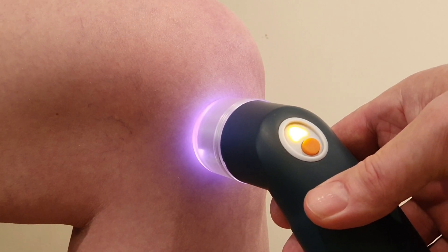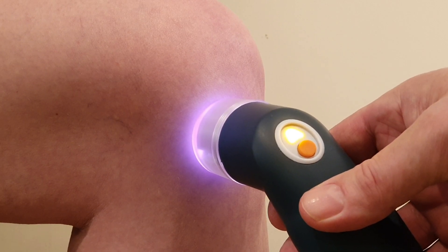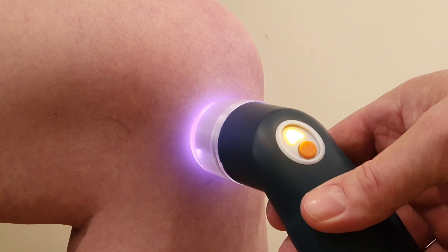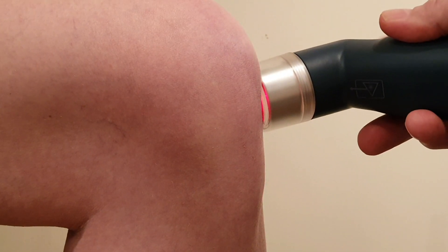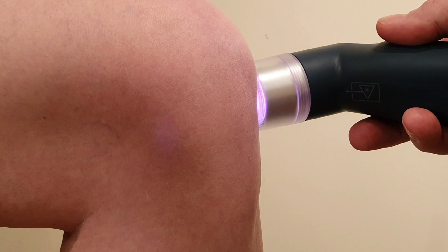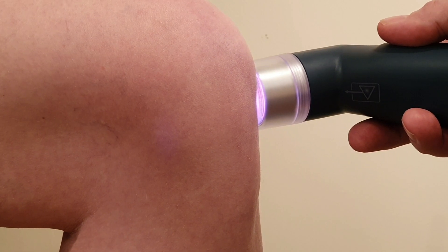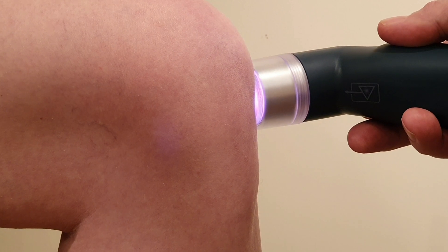There would be an argument for using a single probe because the joint space is not that wide. I prefer to use a cluster just because it covers a bigger area — that's point one. And I prefer to have the knee bent. That opens up the anterior joint line, allowing more of the laser to get in. You can do this on a normal clinic bed by just putting a towel underneath the back of the patient's knee. Some people have preformed sponge rollers to do that — they're fine as well.